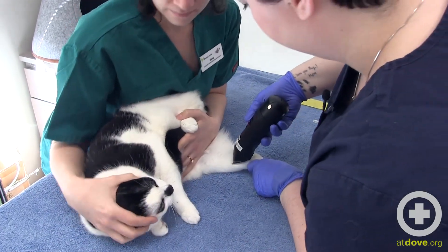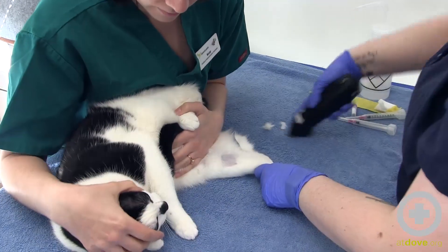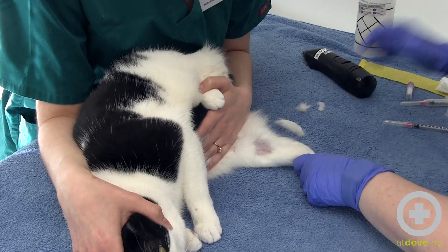I'm just going to shave a spot on her leg here so I can see the vein. Then put alcohol to wet the vein and visualize it better.